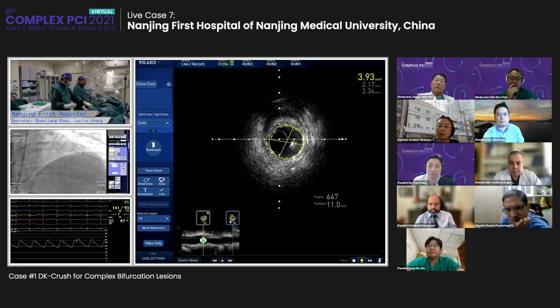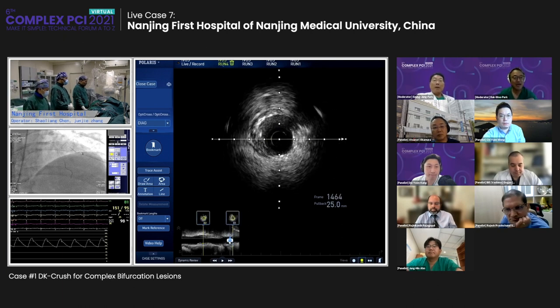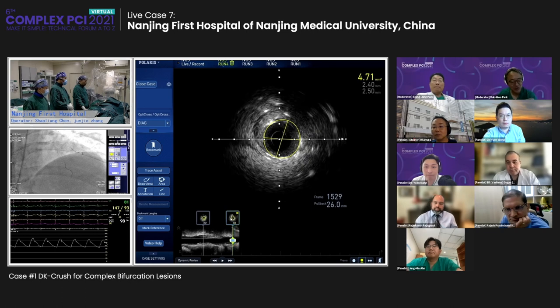So what's your opinion? It's good. The vessel size is relatively small, so there's not too much concern. Yes, 3.94 or something like that. Great. Okay, thank you. I think for this live case, the final result is excellent.